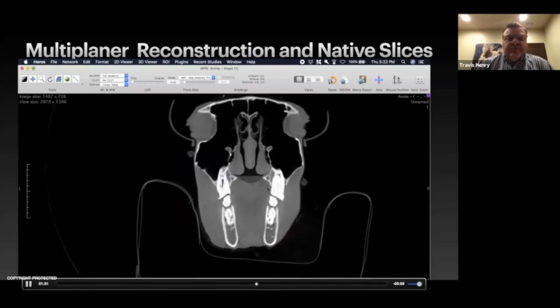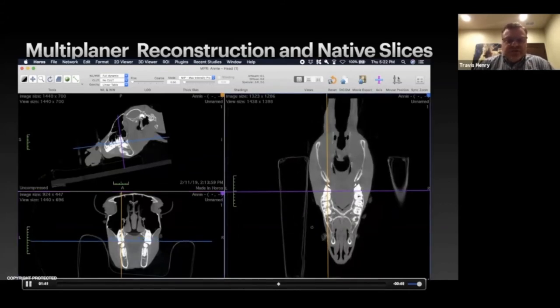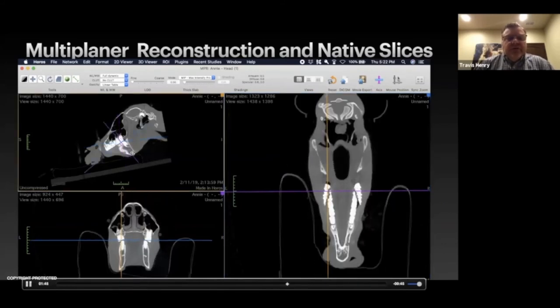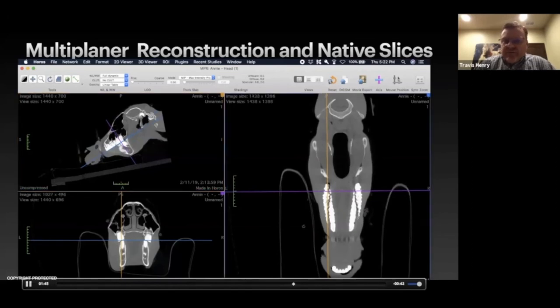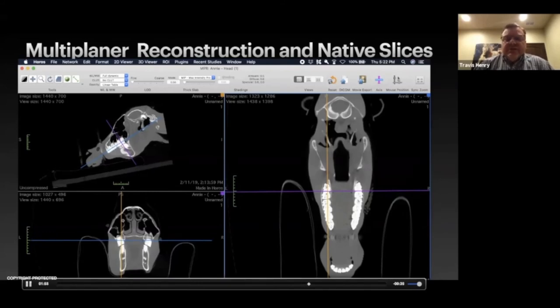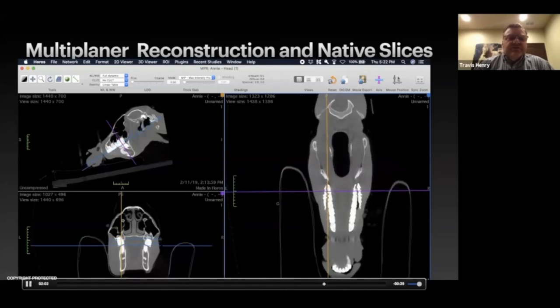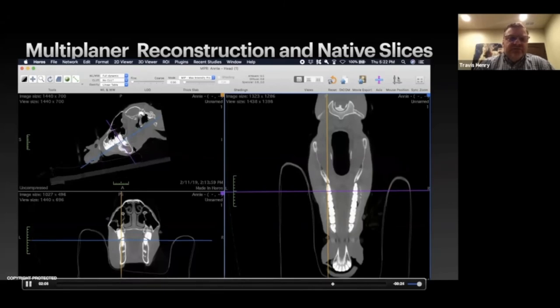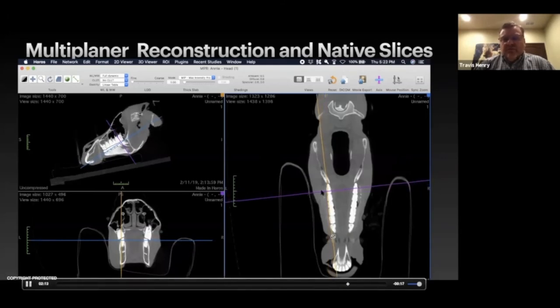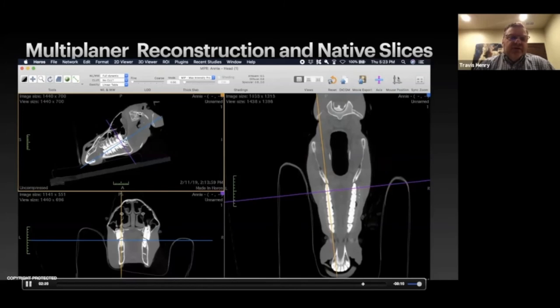Double-tapping on a particular image blows it up to full screen. This shows how powerful CT can really be — it's not just scrolling through transverse slices. When we talk about teeth that have five pulp horns, a common chamber, three root canals in the maxillary teeth, and two infundibula, there's so much information in each tooth. Using MPR we can angle up through a tooth on the dorsal plane, and here I'm also correcting for the shape of the mandibles by moving the yellow line to see all mandibular teeth when evaluating for periodontal disease.